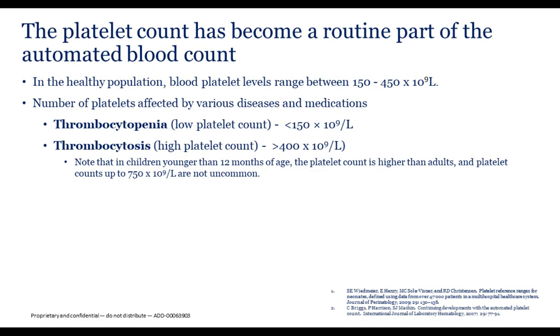The platelet count has become an accepted part of the automated blood count. The clinical value of platelet counting is a critical aspect of patient diagnosis and treatment monitoring, and demonstrating normal platelet counts in subjects tested as part of a wellness check is valued and important as part of a pre-surgical screening process. Reported reference ranges for the platelet count of normal subjects typically fall in the 150 to 400,000 range. Demonstration of thrombocytopenia or thrombocytosis are valuable, if not specific, findings in the context of disease diagnosis.